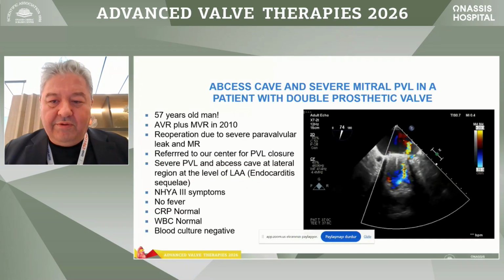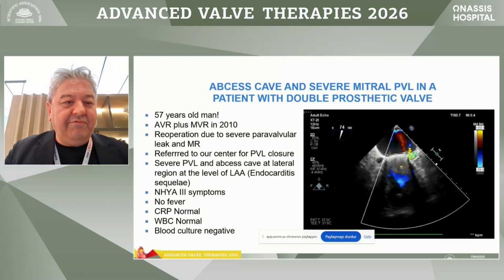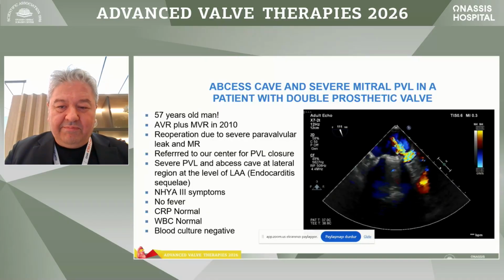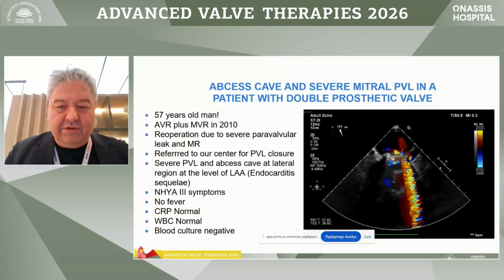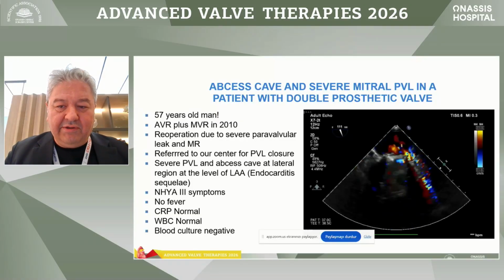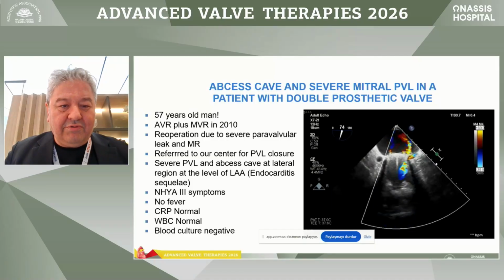I want to show you a very interesting case. It's a 57-year-old man. Aortic valve replacement and mitral valve replacement were done in 2010, and reoperation due to severe paravalvular leak and mitral regurgitation, and he was referred to our center for paravalvular closure.